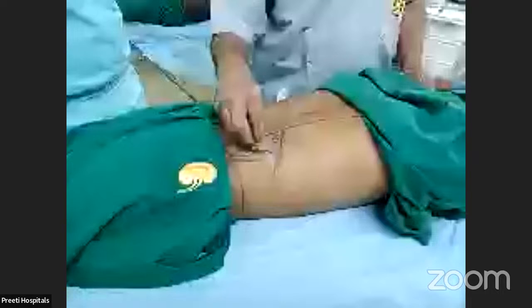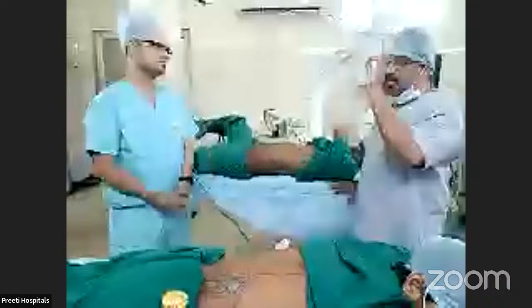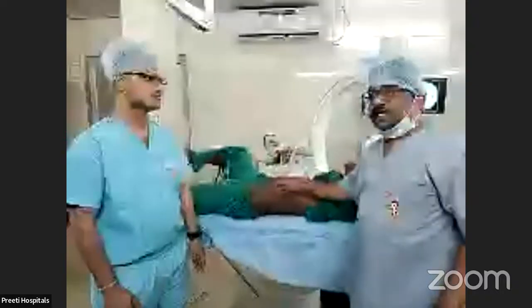Pelvic stone plus middle calyx. You have a middle calycial stone. How will you do it? So say if you don't know the anterior and posterior calyx, then supine PCNL. If the middle calyx is there and a pelvic stone is there, supine PCNL is very good because you will go in line with it. The needle will move into the calyx nicely, you can go to the anterior and posterior.